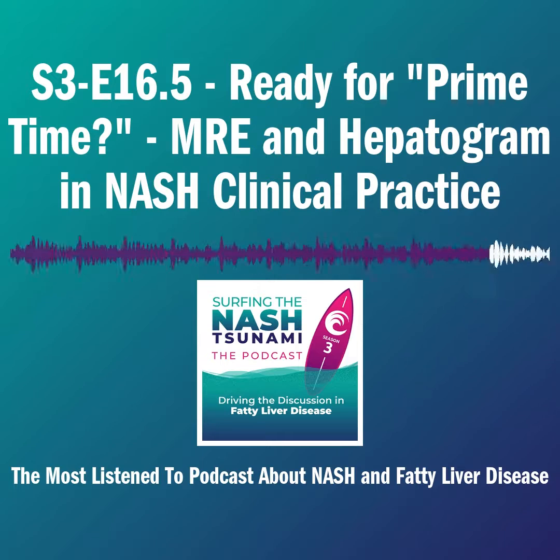Okay, thanks, Mazen. Scott? Well, I agree with all of these comments, and I would just add a couple of things. First of all, I think the one myth that we all need to get past is this whole myth of MRE being so expensive, and we've talked about that already. That's simply not true anymore. 20 years ago, perhaps, that was the case, and the cost is really on the order of the other non-invasive tests that are being performed.